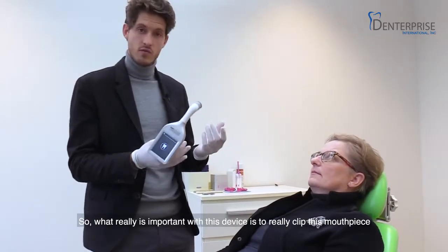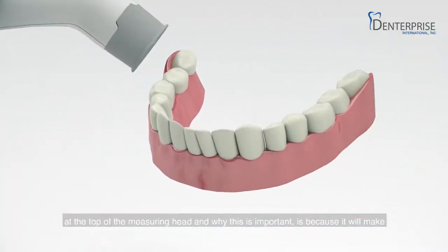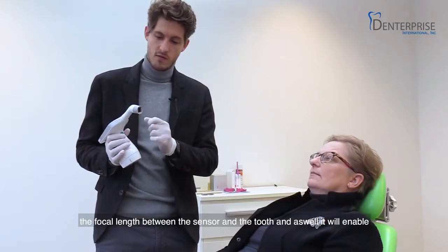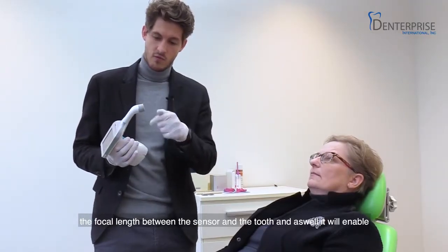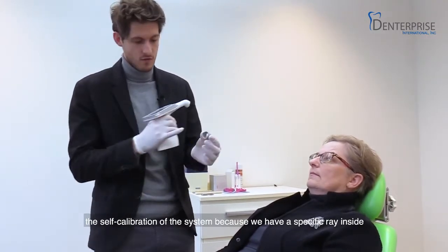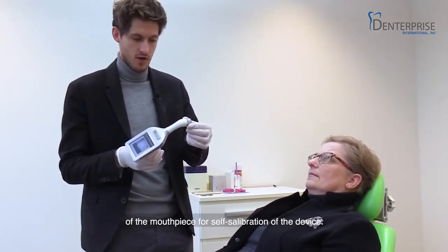So what is really important with this device is to really clip this mouthpiece at the top of the measuring head. And why is it important? Because it will make the focal length between the sensor and the tooth, and as well it will enable the self-calibration of the system, because we have a specific gray inside of the mouthpiece for self-calibration of the device.